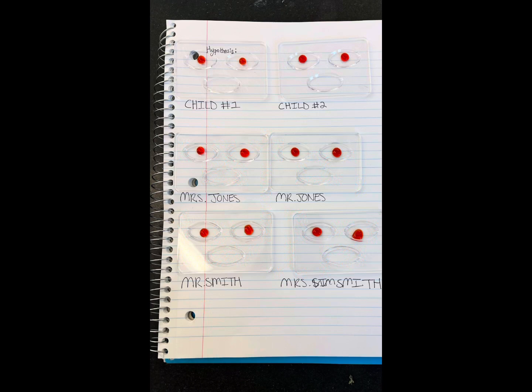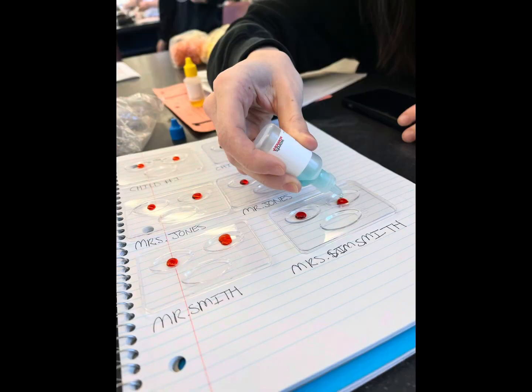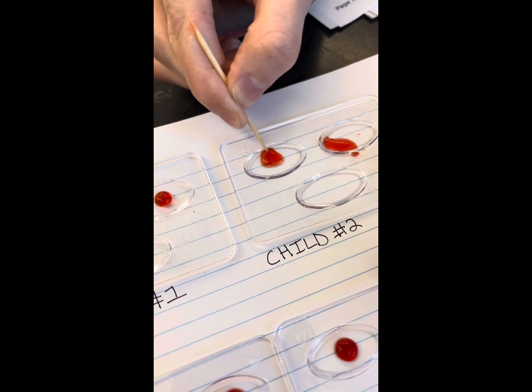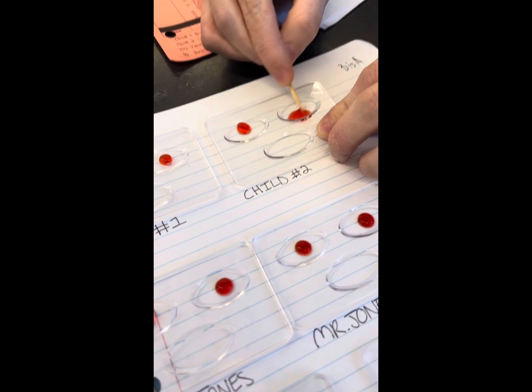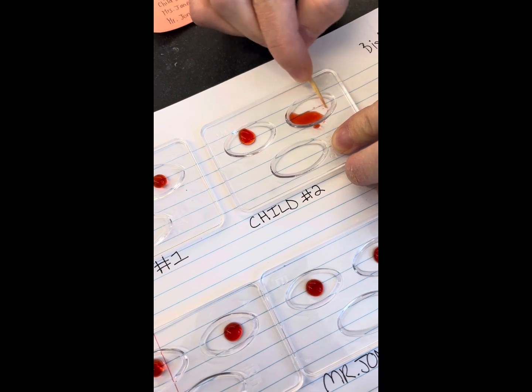To determine each individual's blood type, we sorted each plate into 2 parts, using the same blood except one is labeled A and one is labeled B. This is because we will be inserting 2 different anti-serums to check for agglutination. If agglutination only occurs in the place that the anti-A serum was added, the blood type is A. If agglutination occurs only in the place that the anti-B serum was added, the blood type is B. If agglutination occurs in both, this indicates the blood type is AB, and if there is no agglutination in either, the blood type is O.